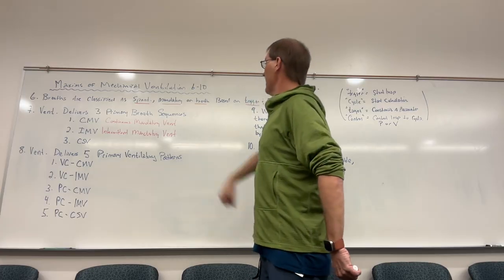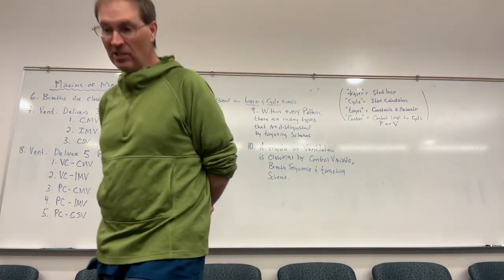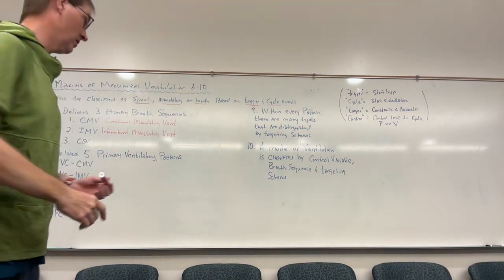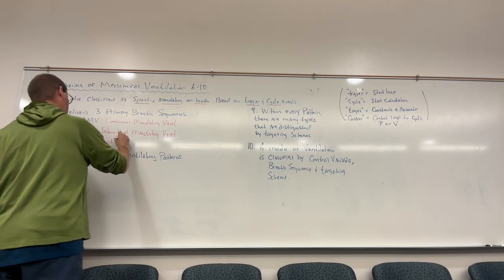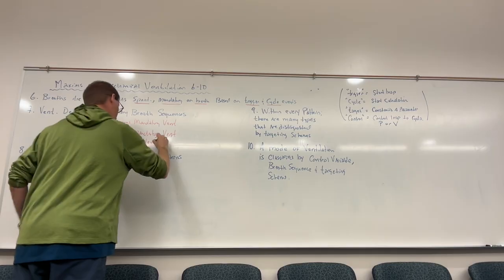mandatory and spontaneous breaths. And so, as you might imagine, CSV is continuous spontaneous ventilation. All right.